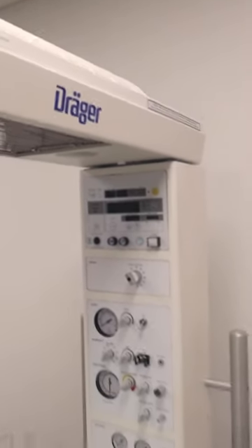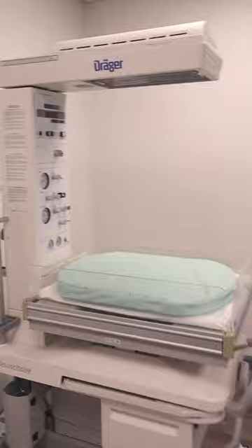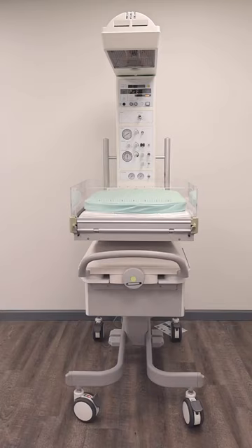The Draeger AirShields Resuscitare is a radiant infant warmer that combines an effective warming therapy platform along with the components you need for clinical emergency resuscitation. The Draeger Resuscitare offers a blender, suction, flow meter, and positive pressure mounted on the bed for easy accessibility.